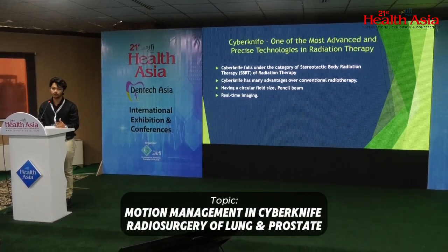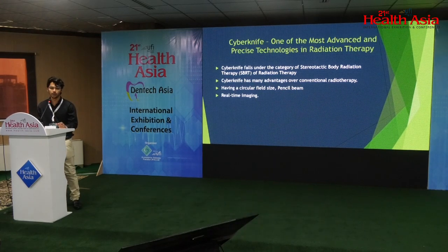Because conventional radiotherapy has a rectangular field size or a customized field size if it has MLCs involved. But Cyberknife has a circular field size which gives us the ability to treat tumors as small as 5 millimeter in size, which is very precise, which in return helps us save healthy tissue and maximizes radiation to the tumor.